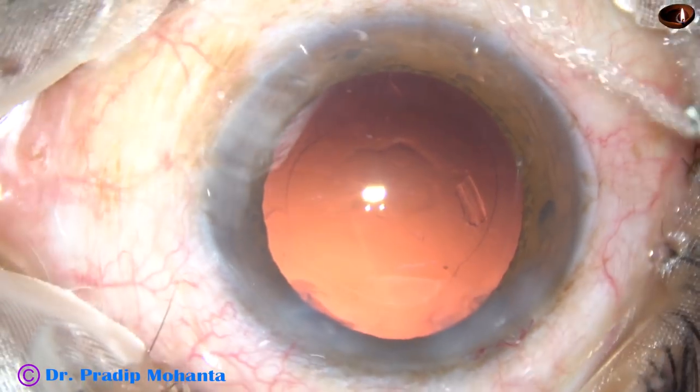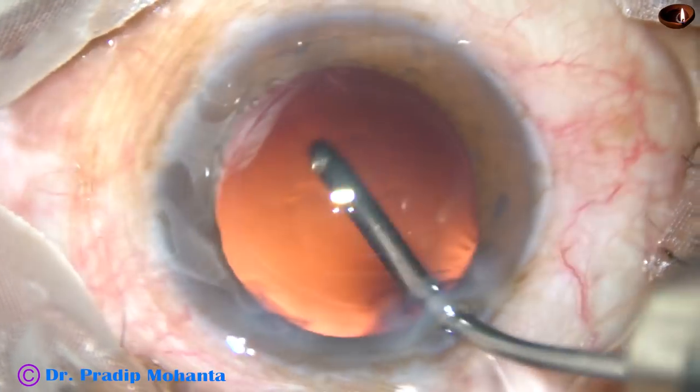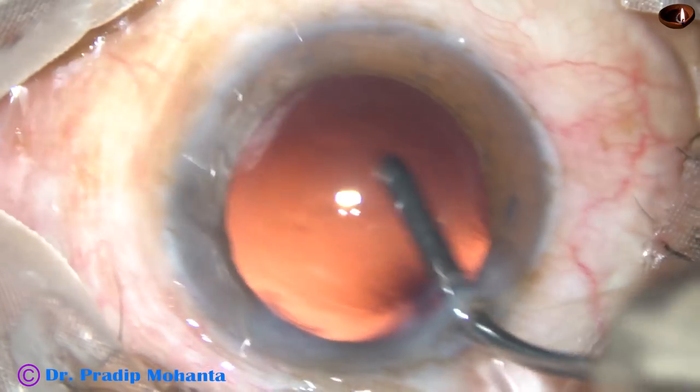And now this is hydropolish — polishing the posterior capsule with the help of a fluid jet.